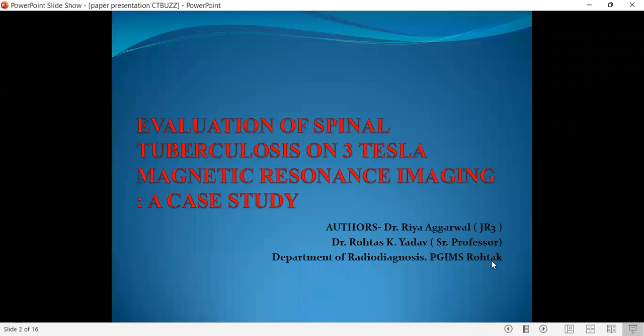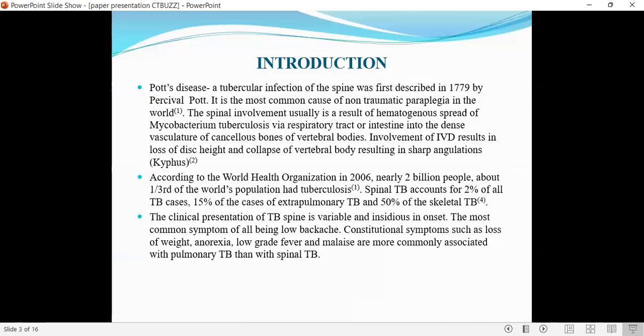Evaluation of spinal tuberculosis on 3-Tesla MRI: a case study. Pott's disease.